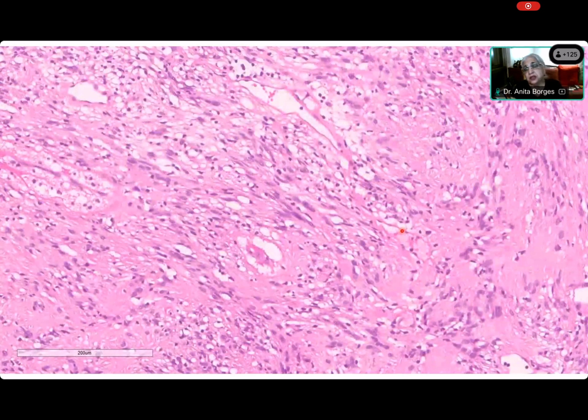And now what are we seeing over here, Saida? This is an Antoni B area. You see this? And you know what it reminds you of? We just saw it a little while ago. You saw it in that gastrointestinal stromal tumor. You saw the vacuolation of the cells, and the coalescence of the vacuoles within the cells, and the cells then die out. That is why you saw pseudocysts over there. And so often, if you have a lot of Antoni B areas in a schwannoma, it becomes cystic. That's how schwannomas sometimes just present as cysts.